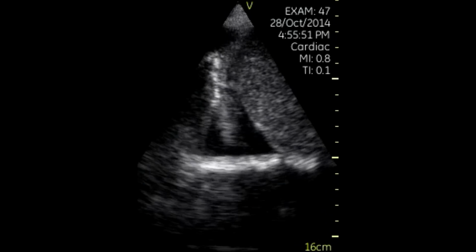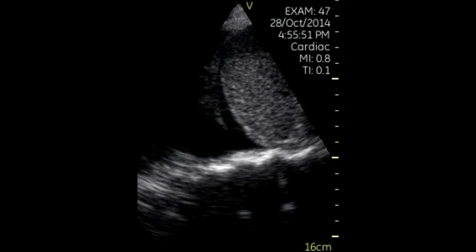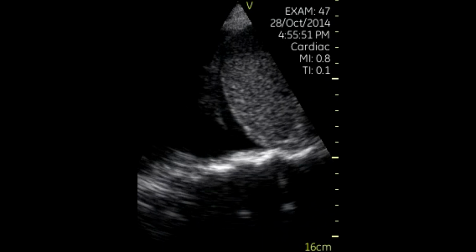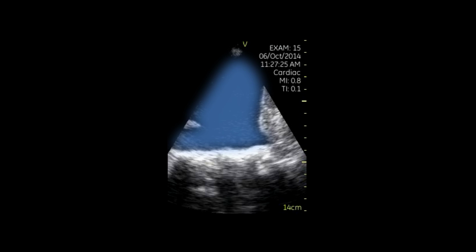When pleural effusion is present, there will be an anechoic wedge-shaped area above the diaphragm. This fluid-filled area acts as an acoustic window, providing an unobscured view of the vertebral bodies cephalad to the diaphragm. This is called the spine sign. Effusions can be large or small.